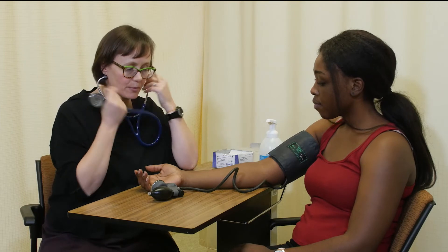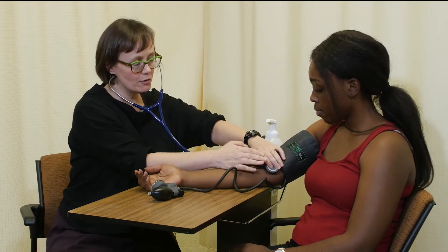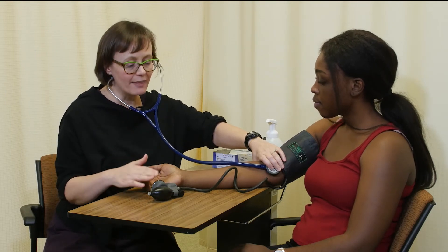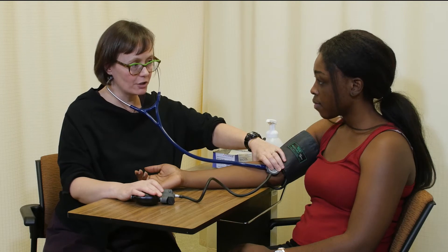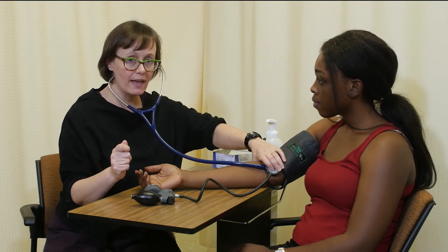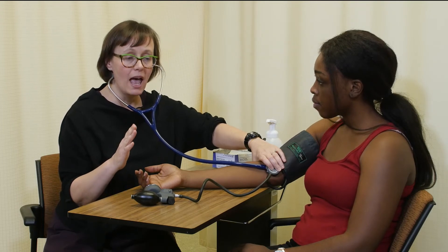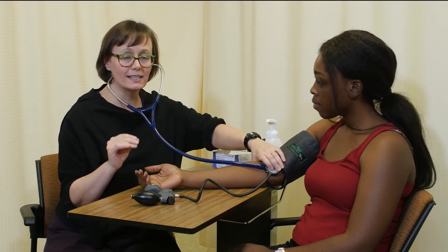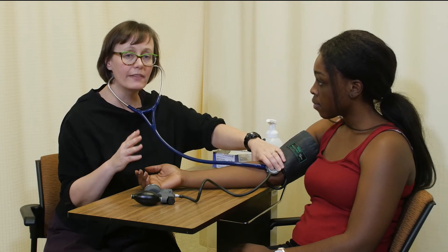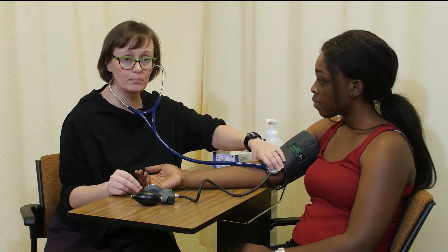When we go to take blood pressure, I'm going to place the cleansed end of my bell over your brachial artery. Blood flow is unobstructed at this point, so I won't hear anything — blood flow is silent. I'll inflate the cuff to your maximum pressure inflation, which is 130 millimeters of mercury, then slowly open the valve about two to three millimeters of mercury per second. As the needle comes down, the very first Korotkoff sound is systolic blood pressure. Those sounds will continue to change in quality, becoming muffled and then going silent — the very last Korotkoff sound is diastolic blood pressure.